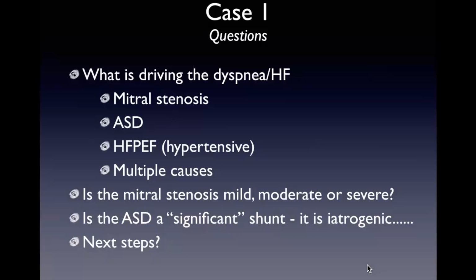Yeah, well, I actually have one note on that here. There are times where with mitral stenosis, because a lot of symptoms are exertional, we could do an exercise test just for pure exercise tolerance. There's some data on how high the gradient or RVSP could get with exercise that might signify a worse prognosis that might drive intervention. Having said that, there are no randomized studies of exercise testing to drive intervention and then subsequently show an improvement in that.